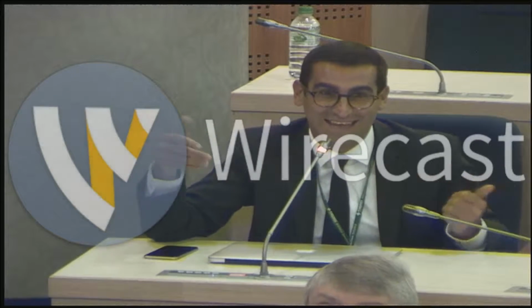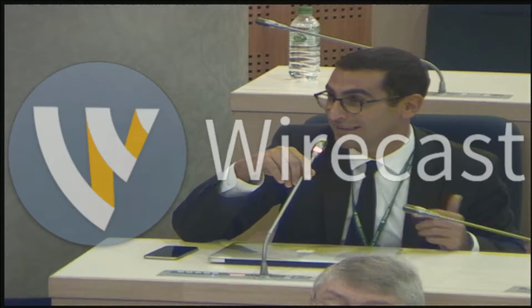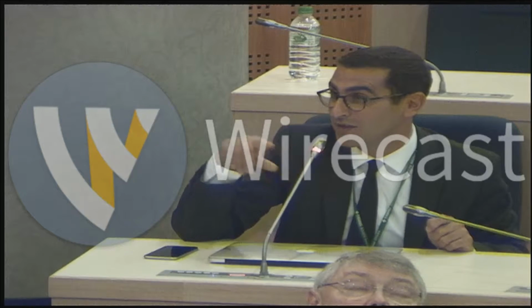In my experience, it's a step you can succeed with, and afterwards you can use the Flush Knife again. Of course, we prefer to use only one knife. But for beginners, I think it could be safer and helpful to use this clutch cutter. So selecting devices depends on the learning curve and the situation. Exactly. All circumstances should be considered. Exactly.